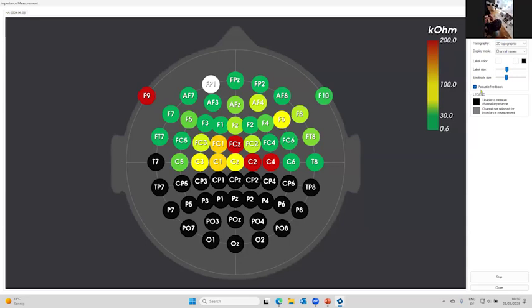So again, we are now at the area where Christoph has more hair, hence I'm doing these movements. Over here, this electrode floats a bit, number 26. So in those cases, you can use the tape, or you simply inject a lot of gel, like I did. So T7 is now green.